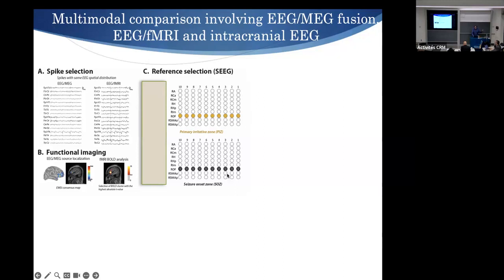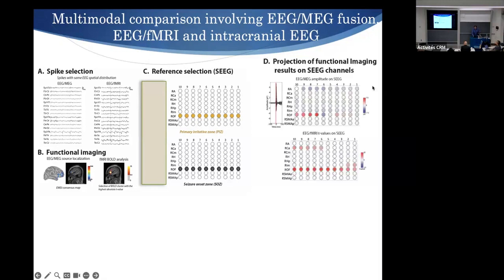So that was done by Shifao. And this is done by the expert then. And then what we generate is from our data. So this is our MEG estimated SEEG. So when you apply the forward model on this, you get your potential in microvolt, and you see the involvement here, mainly in those regions.